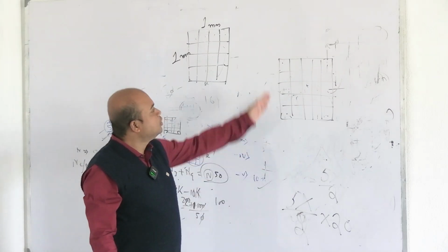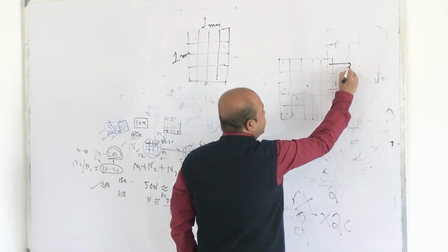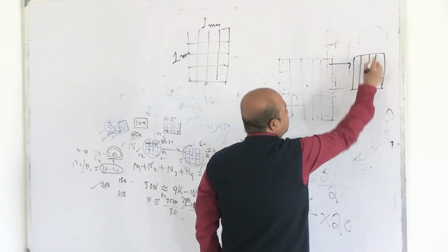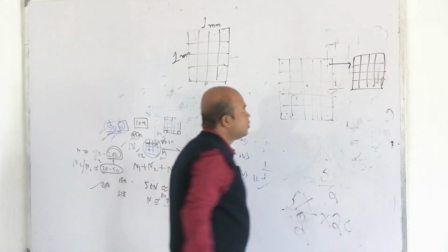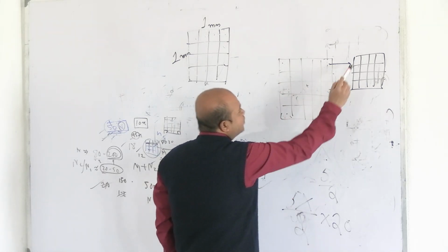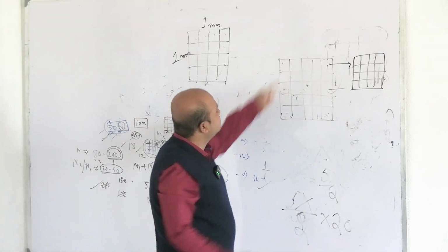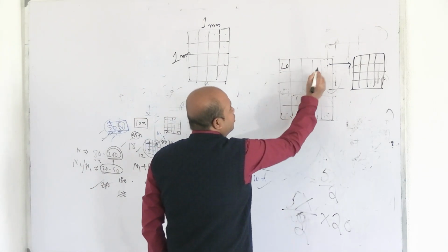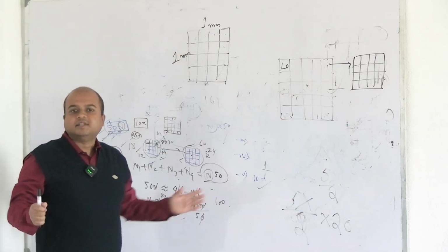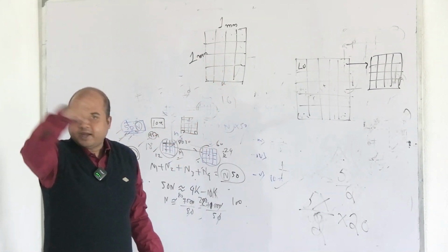Now, due to how the triple lines divide it, already you know, every square of this 25 is divided into how many more? 16. That is 4 into 4. So it is 1, 2, 3, 4, 5, and this is 4 into 4. Now for counting each such square, maybe this is the left upper of the RBC squares. WBC squares are also counted as left upper, right upper, and it is easy to find. That is the left upper square.